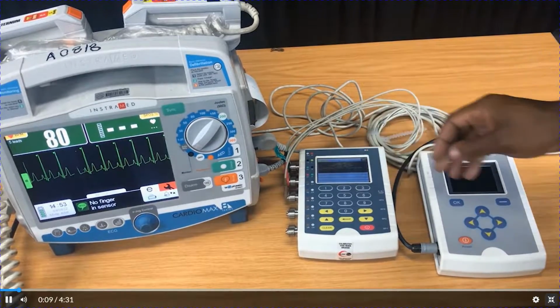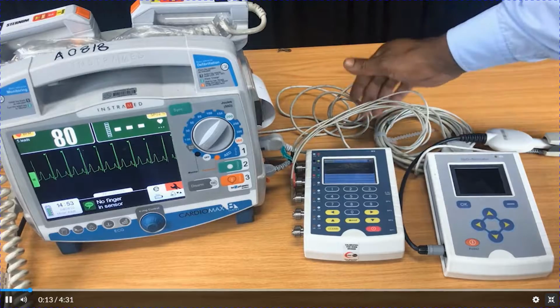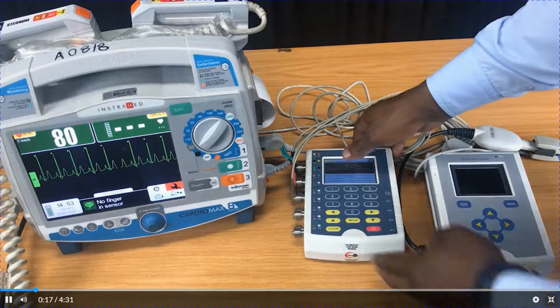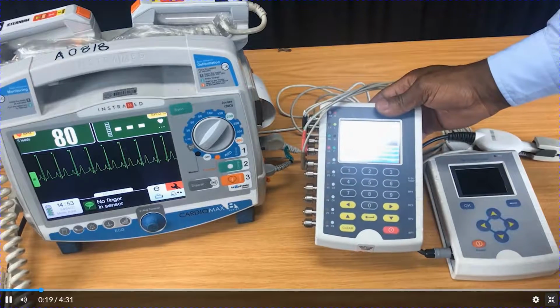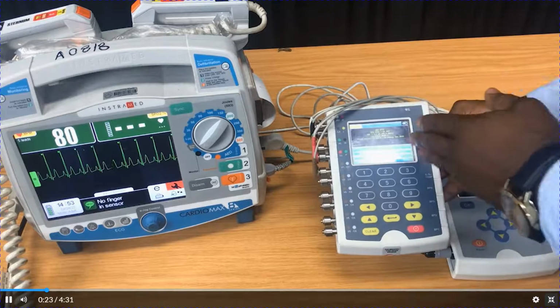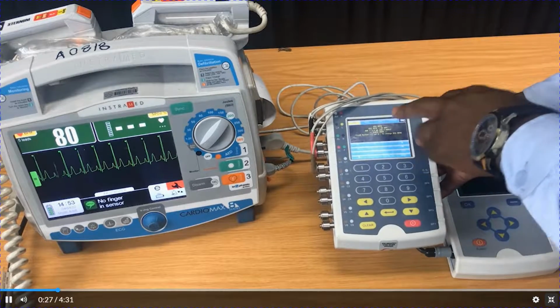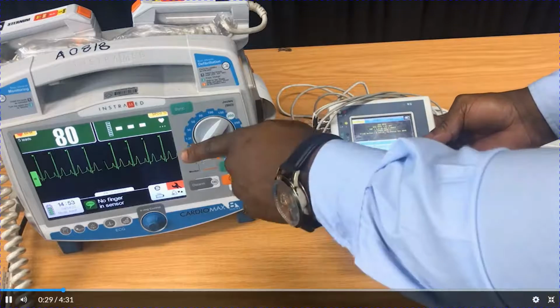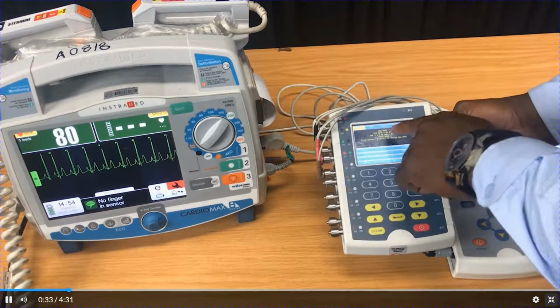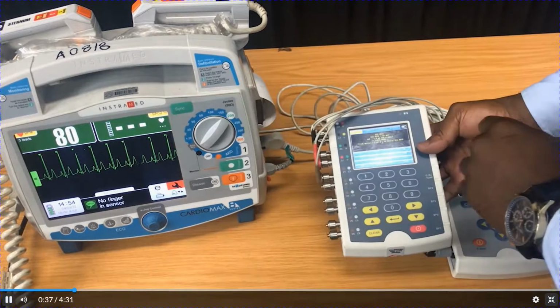So the next test we're going to do is to check our accessories, which is your ECG cable and your SpO2. So we're going to use the ECG simulator for that purpose. And what I'm going to do is select a normal sinus rhythm that is displayed currently on the equipment. So my heart rate on this normal sinus rhythm I have selected is 80 beats per minute.